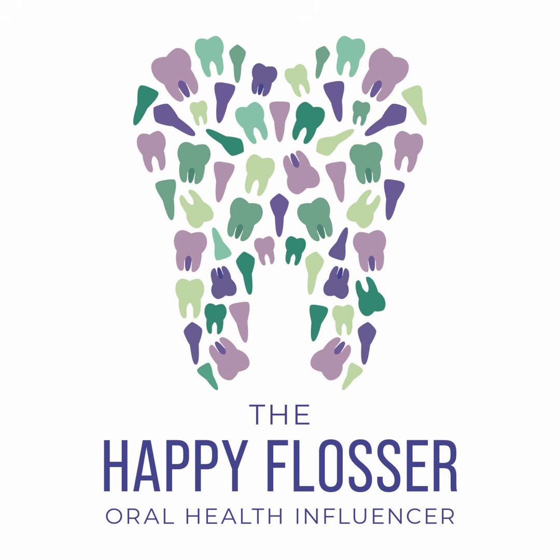So for this patient who has a current full mouth series that's about 3 years old, we would take updated bite wing x-rays and possibly a Panorex depending on the assessment findings. This is routine care. This is a patient who doesn't present with any issues or trauma.